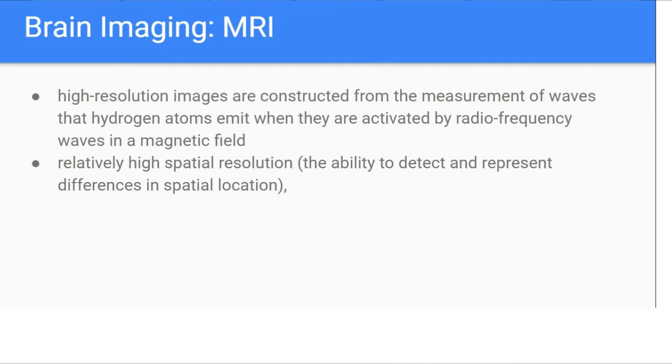Brain imaging means that we try to take some kind of image of the brain. So, some kind of picture of the brain that we obtain, so that we can come to know what kind of configuration, in terms of function or in terms of structure, exists in the brain. Okay, because we want to understand the structure and function of our brain by utilizing different kinds of methods. So MRI is such a fabulous method.